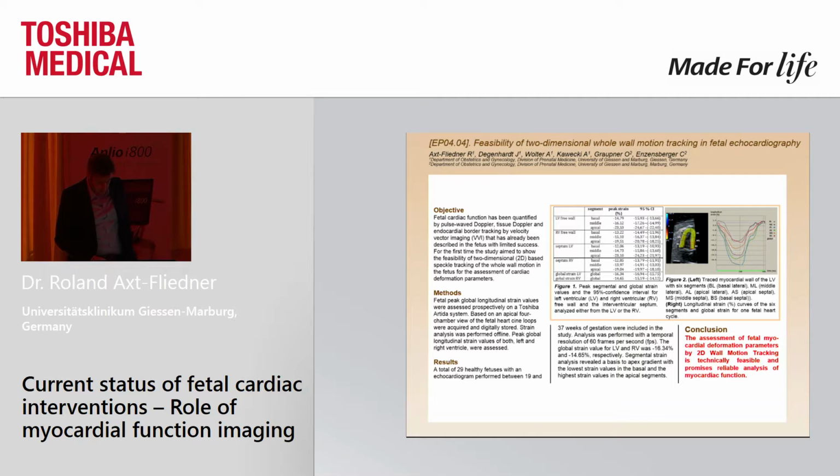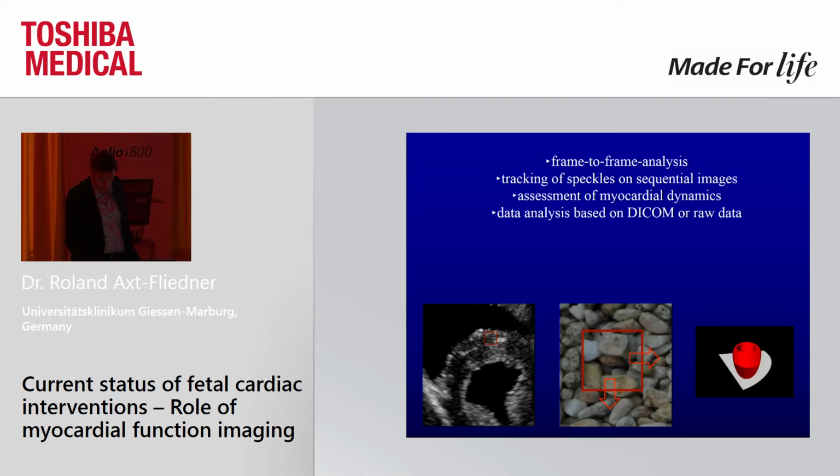Then our group, and namely Christian, elaborated the topic of speckle tracking with the Toshiba technique, and we showed that the assessment of myocardial deformation parameters by 2D wall motion tracking is technically feasible, and this is also a tool which might promise reliable analysis of myocardial function in the future.